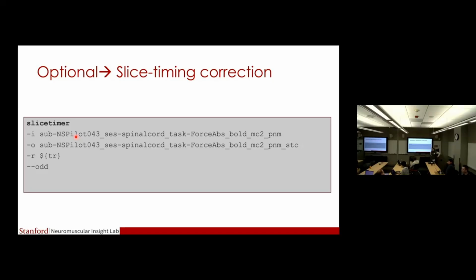Well, why is that optional? I said optional because I know, for example, John Brooks and Falk, my PhD supervisor, were very much saying that you can't do PNM and slice timing together. But you're saying that you're doing slice timing after PNM. After PNM, yes. We never did it before, but actually I think we can do it after PNM. But why is that optional then? I think because a lot of groups are not doing it, so I marked it as optional.